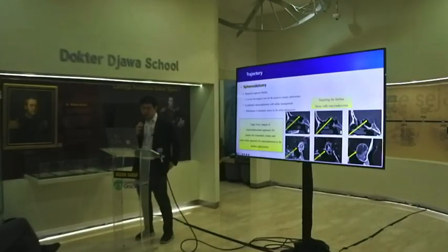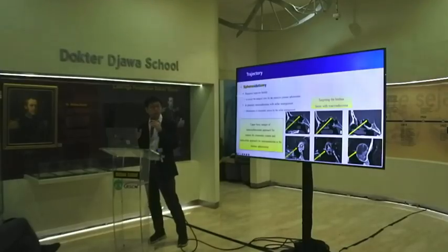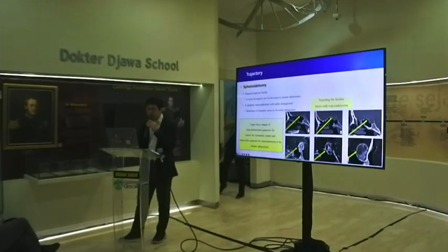We should do the sphenoidotomy first to enter the transtuberculum. It requires the superior border to secure the surgical view for the posterior planum sphenoidale. In pituitary macroadenoma with sellar enlargement, the chiasmatic sulcus is obliterated by the sellar enlargement. So targeting the limbus sphenoidale is very important to expose the transplanum approach.